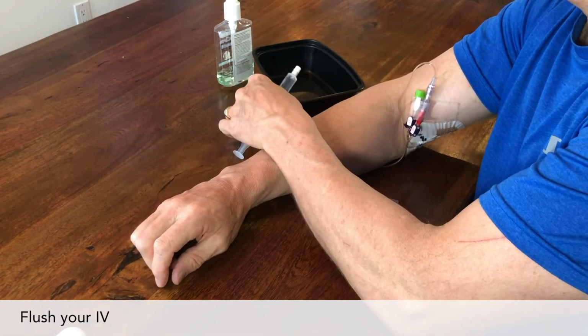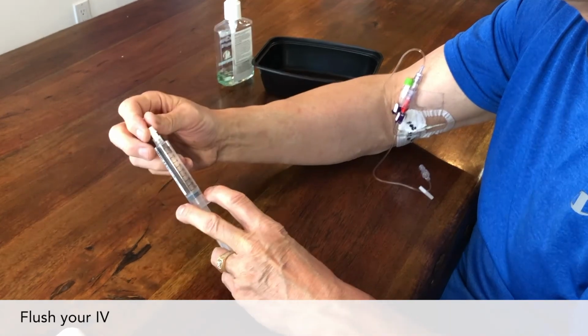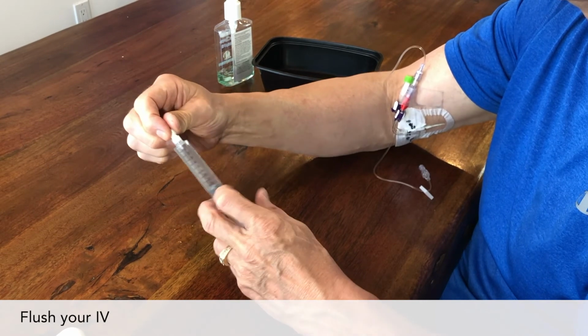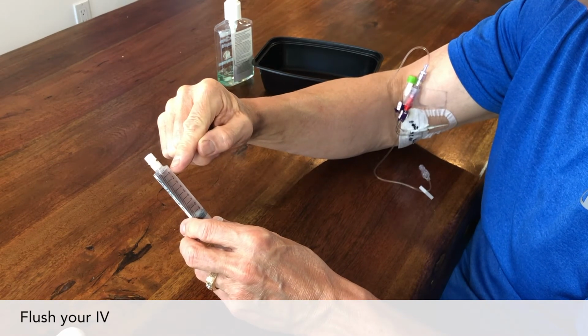Tap the flush on something hard so that the air bubbles rise to the top. Loosen the cap on your flush. Push any air bubbles out. Stop pushing when you see fluid at the top and there's no more air bubbles in the flush.